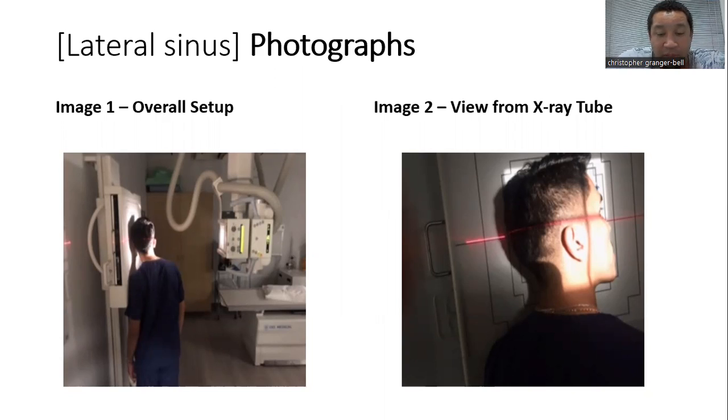I greeted the patient upon her arrival. When she stepped in the imaging room, I verified the patient's information, her name, and her date of birth. I asked her which part of her body was causing her trouble. She told me that the right side of her face was in pain. I verified with her physician via email that the x-ray that he wanted was the lateral sinus.